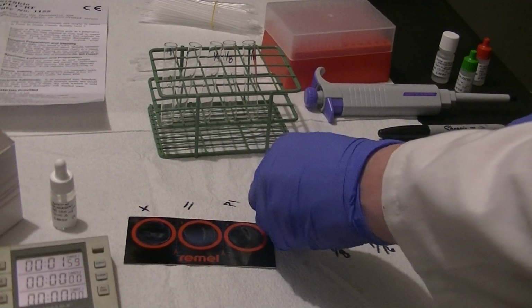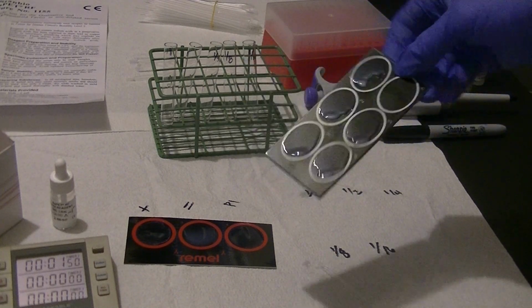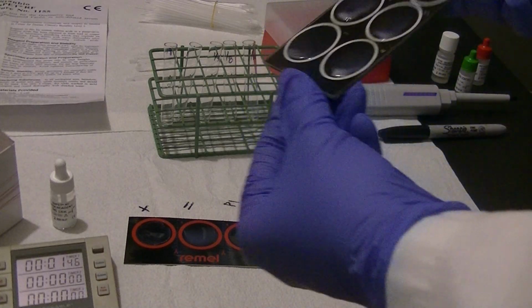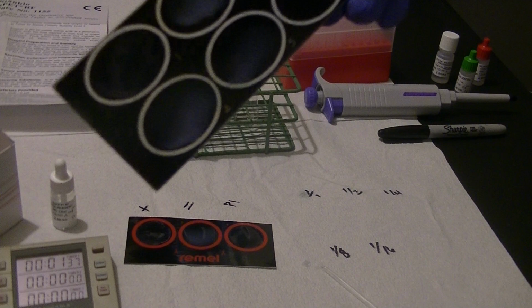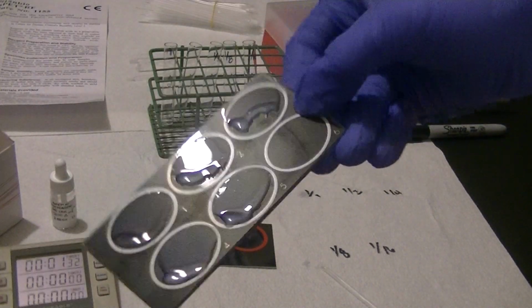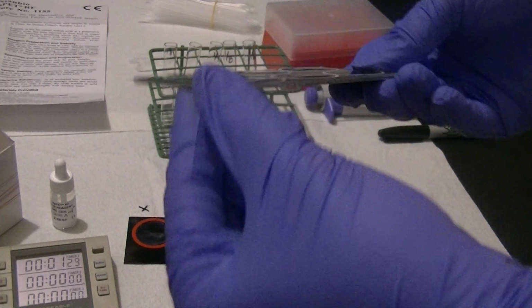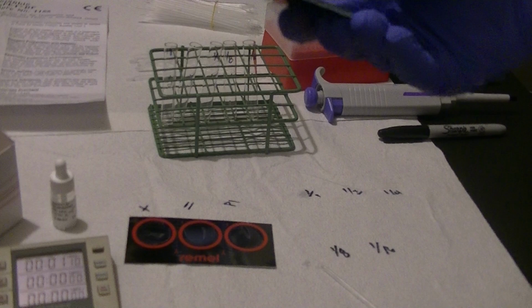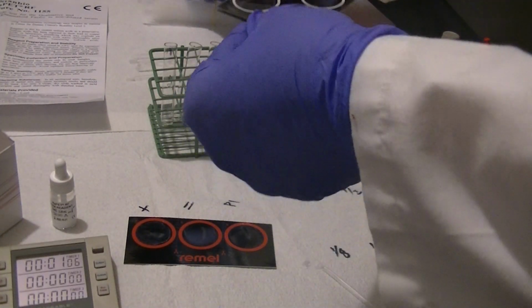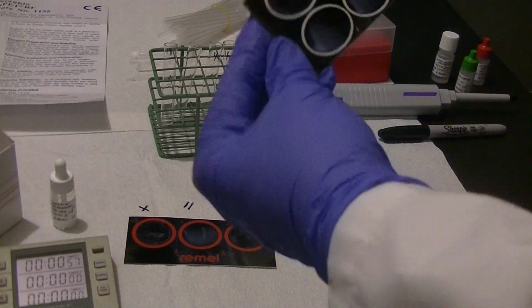Okay, I'm starting my timer for 2 minutes, and I'm going to rotate my card. I'm already seeing that the undiluted patient sample is positive again. All of the others still look negative. One of these actually does not fill the whole circle right now, so I'm just going to mix it a little bit more to make sure it's got a good reaction area there. Okay.